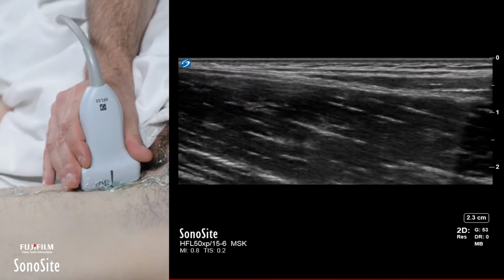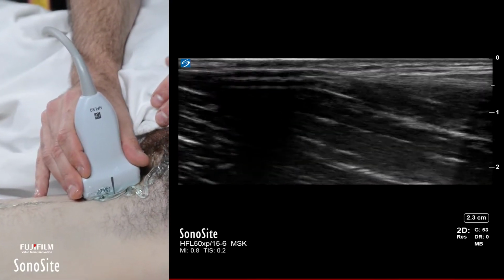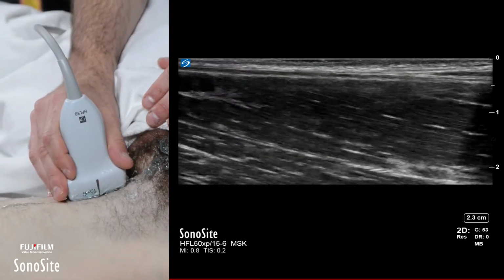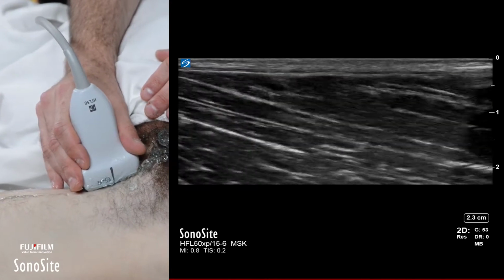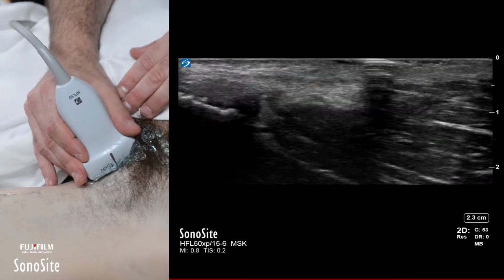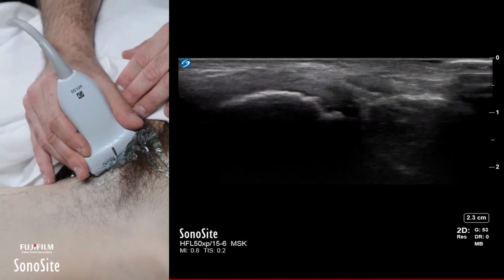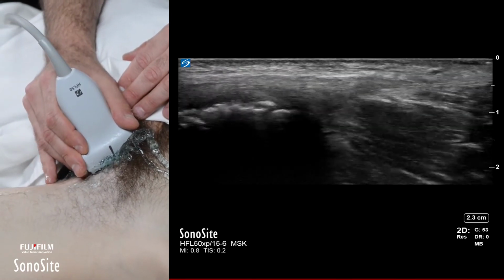and at the top of the screen you can see the tight fibrillar architecture of the adductor tendons. Now, because of the rounded nature of the adductor tendons, sometimes it's easy to fall off, but I can see the tendons. I'm traveling more proximally, and eventually I'm going to be coming into view the pubic tubercle. Now, you can see there is some cortical irregularity in some planes.